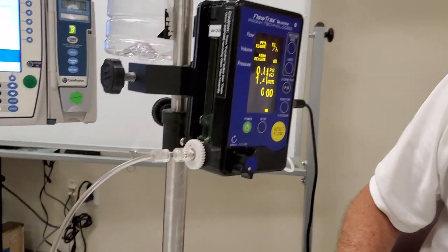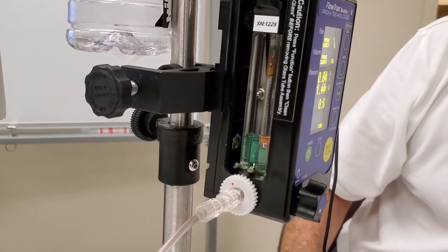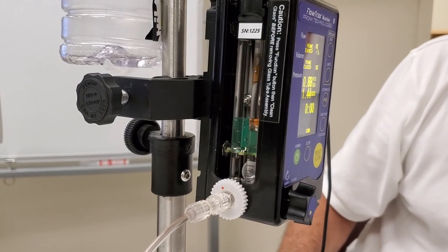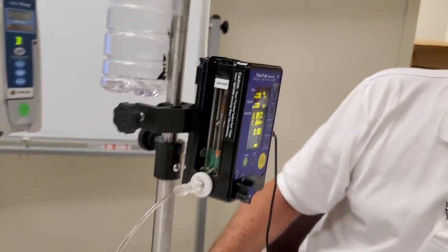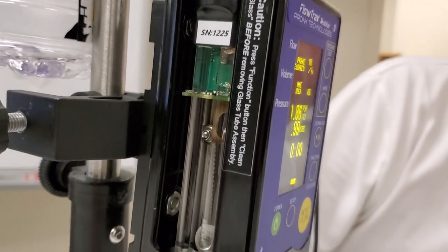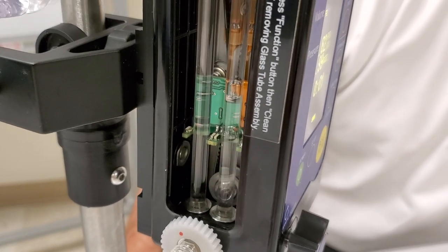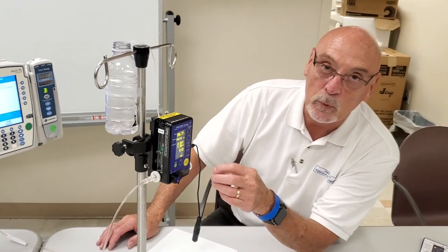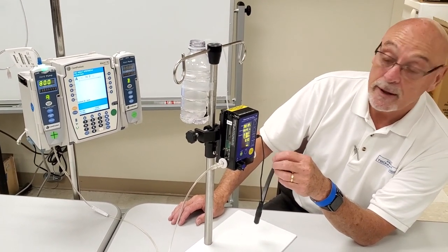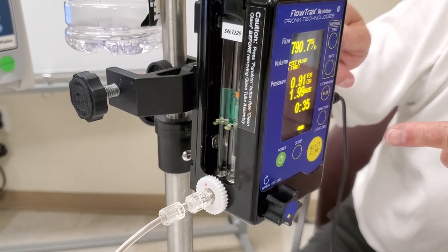When you hook up your IV set, make sure it is totally primed with no air bubbles between the bag and the pump going into the Flow Trax. We've set it up at a high rate of 800 milliliters per hour to make sure we get all the micro-bubbles out of the fluid path. The pump identifies bubbles and follows them through the path. The sensors are on that green carriage going up and down, powered by a stepper motor with 1,000 steps — so in reality we're tracking the bubble in real time and making measurements following the bubble and the liquid.